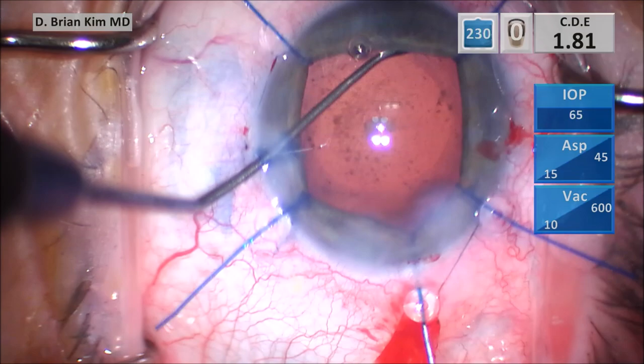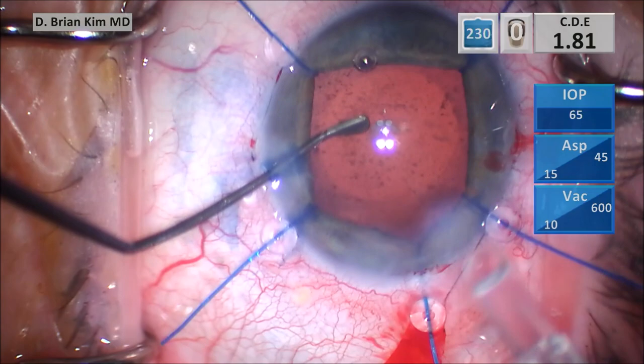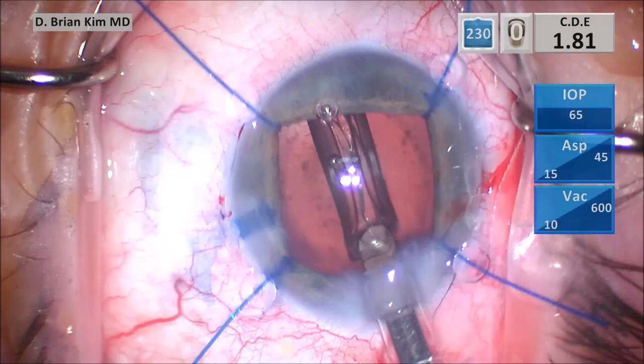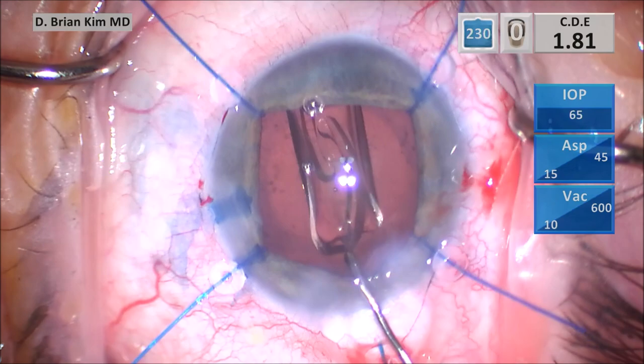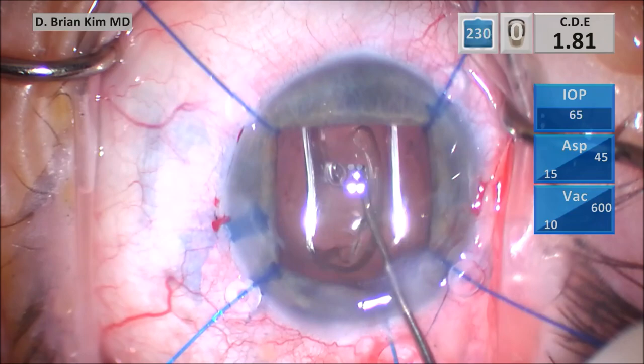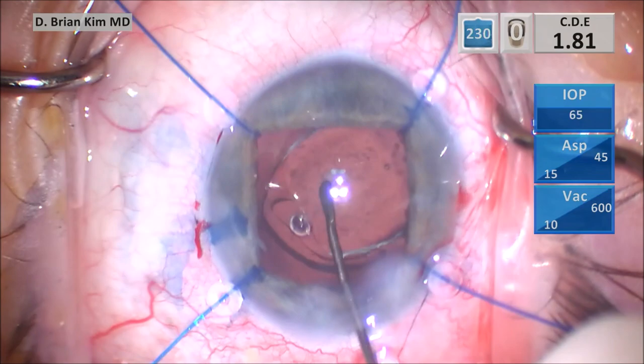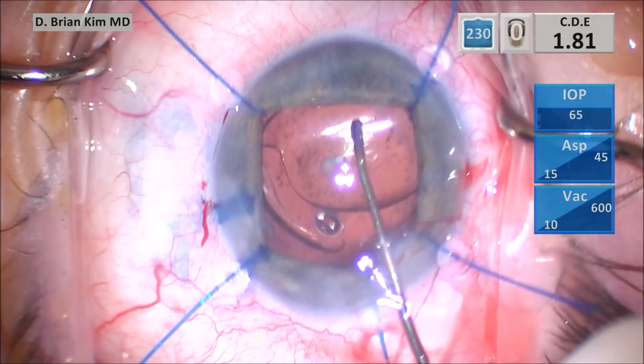Once I'm done sweeping, I go ahead and put the single-piece acrylic lens into the capsular bag. Because I still have the hooks in, I'm going to use the sweep to reposition the haptics. I try to use as few instruments as possible during cataract surgery — since I already have the sweep, I'll use it to help separate the haptics from the optic. That's the key to efficiency: try not to use as many instruments as possible. Going in and out unnecessarily when you can use the same instrument is less efficient.